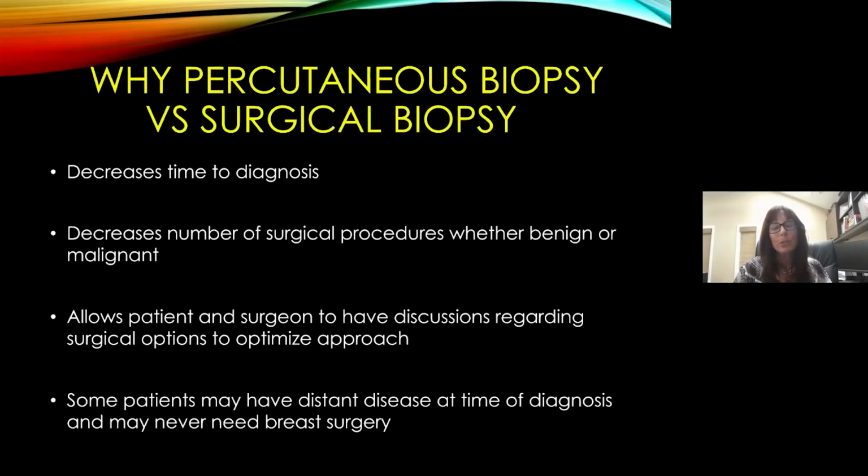So why do we do percutaneous biopsies versus surgical biopsies? It will definitely decrease the time to diagnosis. Many times we can do the biopsies same day or next day, versus a surgical biopsy requires a consultation with a surgeon, pre-op testing, and then getting on the OR schedule.